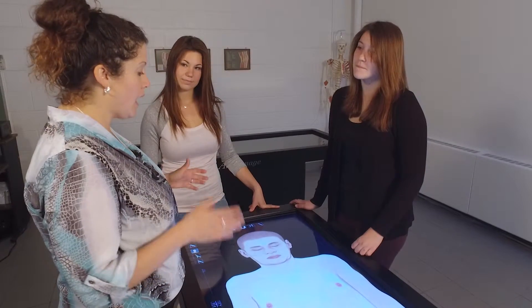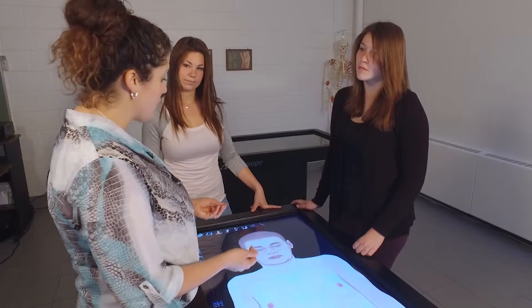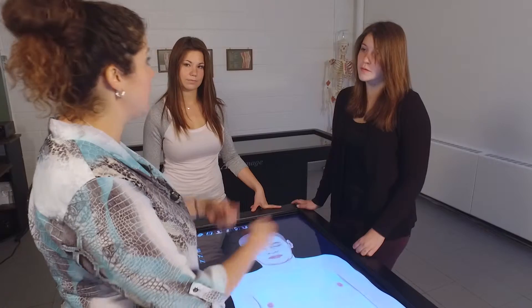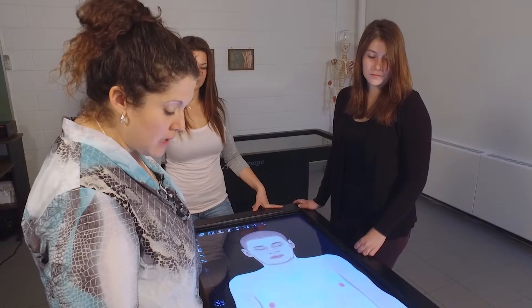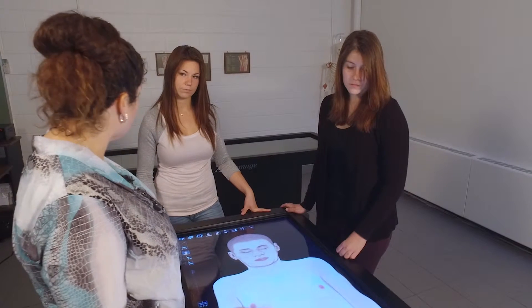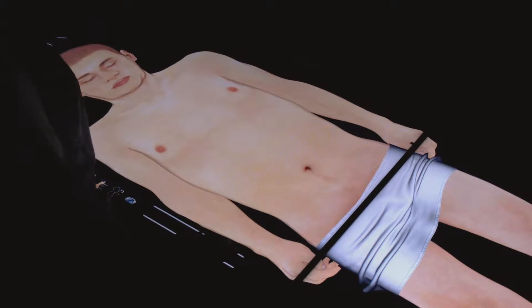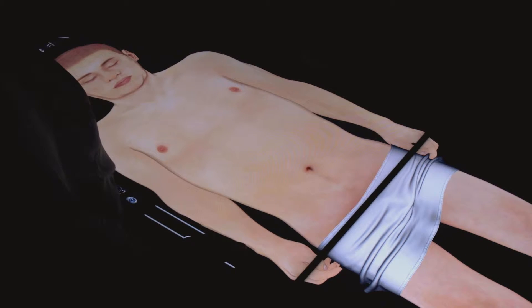If you were using actual real human cadavers, we would have to go through the process of manually removing the skin. Now with this technology, with just a touch of a finger and sliding a little bar, you can actually remove the skin in one swipe and see the anatomy underneath.